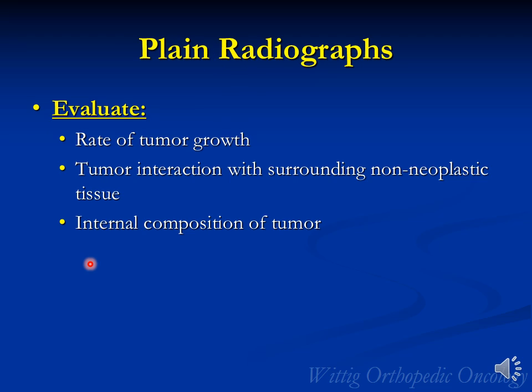Plain radiographs are used to evaluate the rate of tumor growth, the tumor interaction with the surrounding non-neoplastic tissue, as well as the bone reaction against the actual tumor. It's also useful for evaluating the internal composition of the tumor.